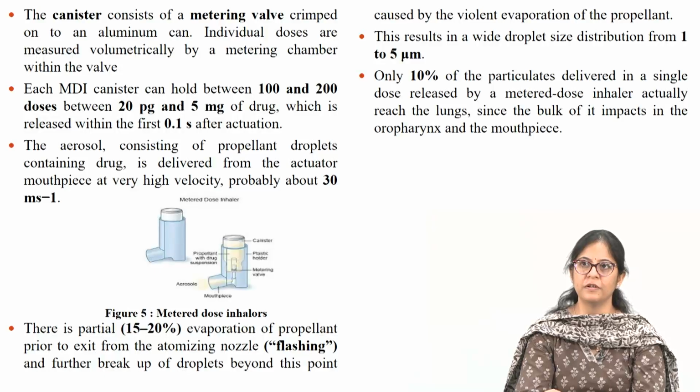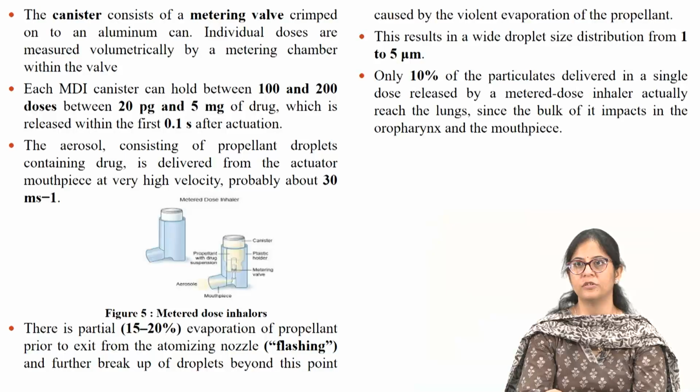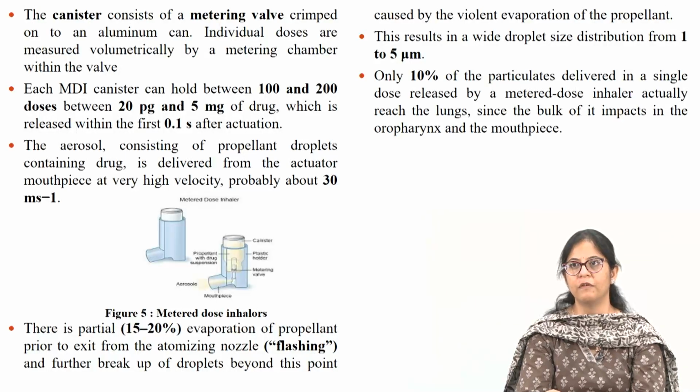Only 10% of the particulates delivered in a single dose released by an MDI actually reach the lung, since the bulk of it impacts in the oropharynx and the mouthpiece.